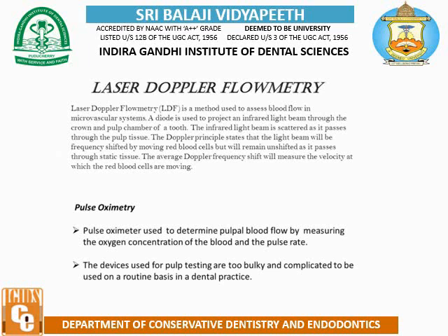The Doppler principle states that the light beam will be frequency shifted by moving red blood cells but will remain unshifted as it passes through the static tissues. The average Doppler frequency shift will measure the velocity at which the red blood cells are moving.